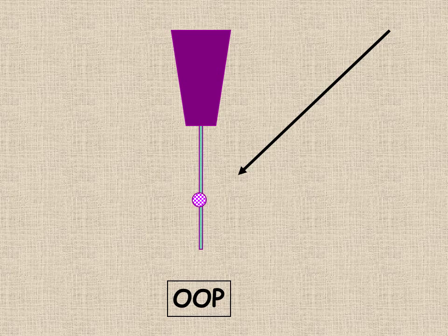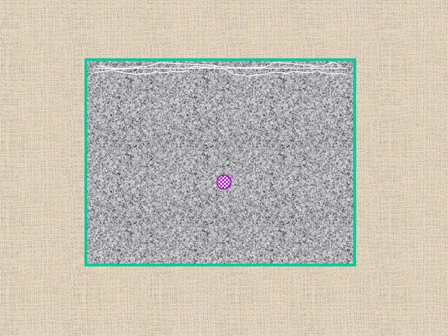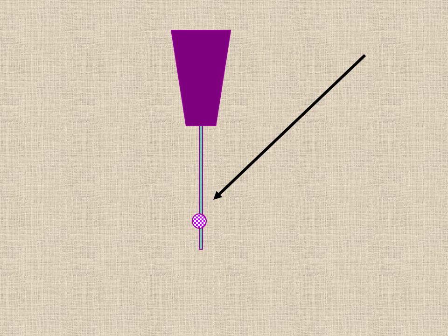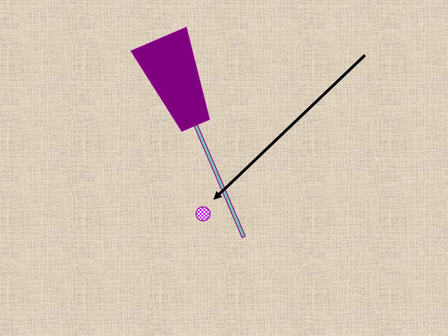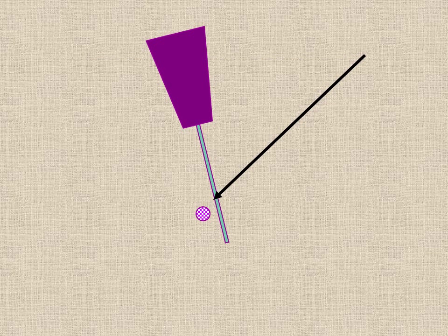If the needle is approaching out of plane, so here we have an ultrasound picture of the nerve with no needle. If we angle our beam up towards the shaft of the needle, we can now see the needle, which appears as a white dot in the middle of the screen, but we've now lost sight of the nerve. If we move our beam down the shaft, there is a double dot, which is the bevel of the needle.